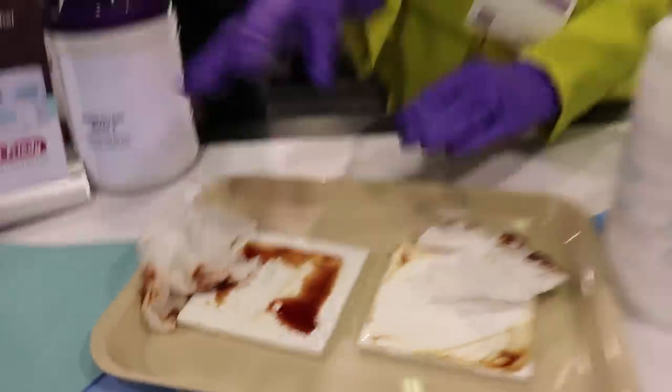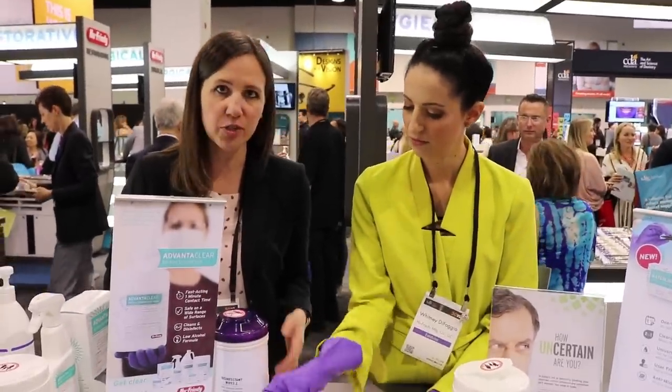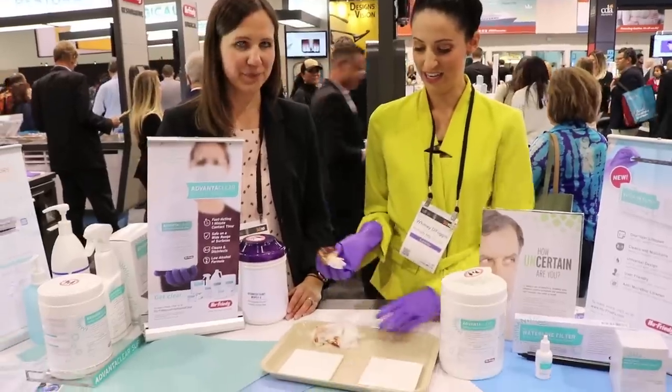That's because alcohol is not a good cleaner. It's a great disinfectant with a good kill time, but it's not a good cleaner. You really can't disinfect unless you clean. And that's why you're getting a good cleaner with the low alcohol, plant-based product called AdvantaClear. There you go.